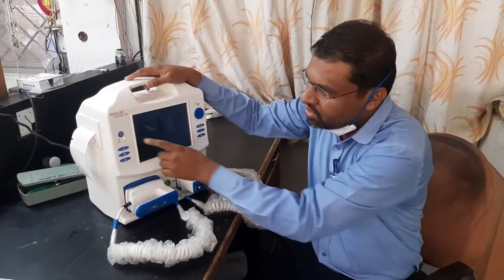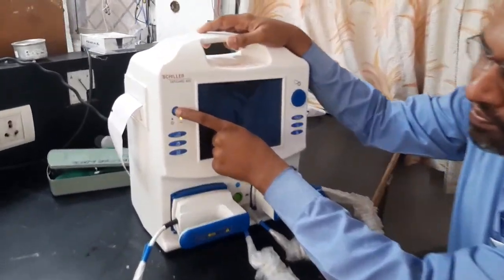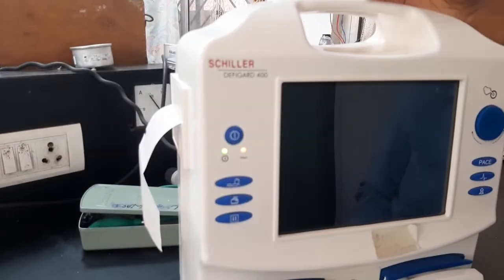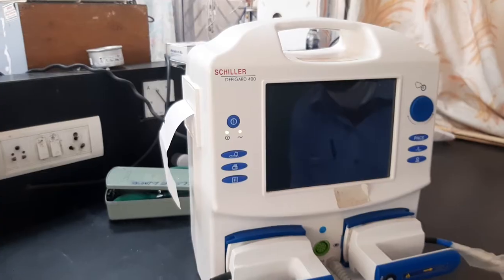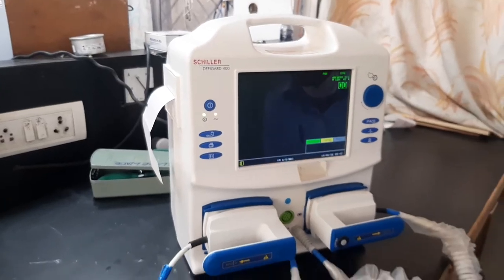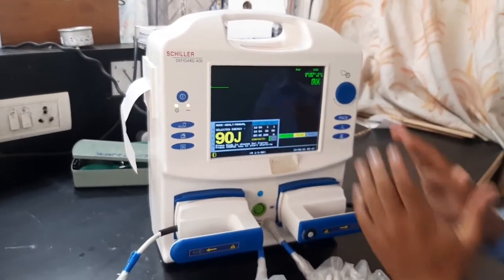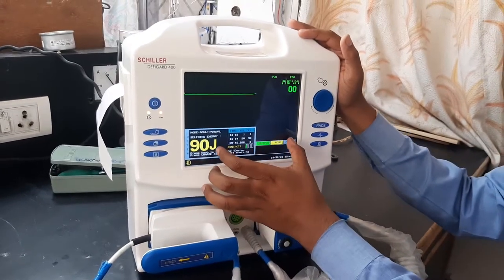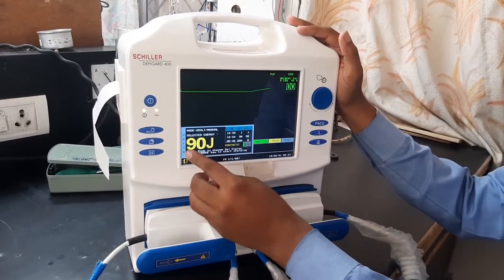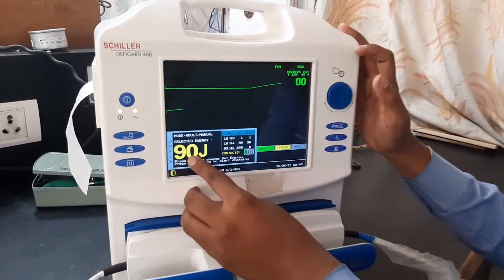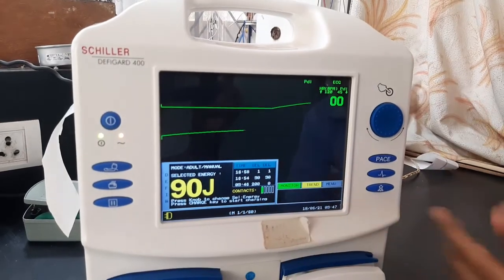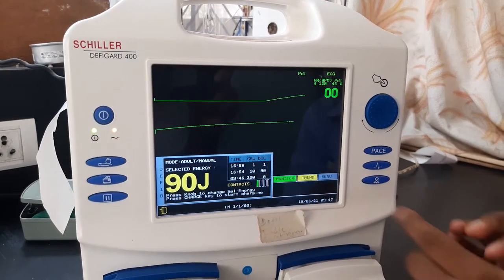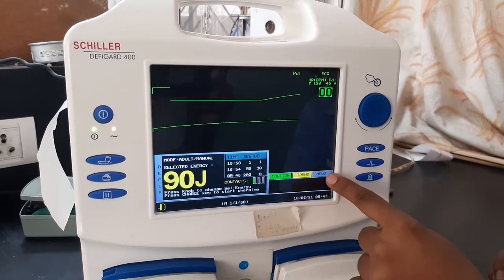To switch on the defibrillator, press and hold — this is a long press. Once the machine switches on, the display comes on. You can observe the energy display here — the unit of energy is joules. You also have monitor, trend, and menu options.